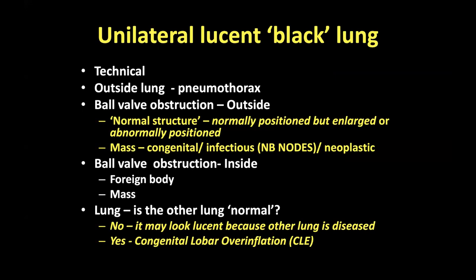Once you've looked at the airways, you need to take it beyond that. We've looked at the black of the trachea and main bronchi; now we look at the lungs. We need to critically evaluate the lungs: is the lung normally black? Have we got symmetrical lucency of the lungs, or is it asymmetrical? Before we start concentrating on things that are white.